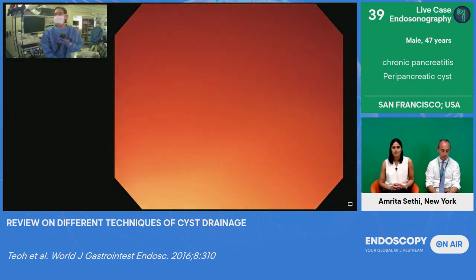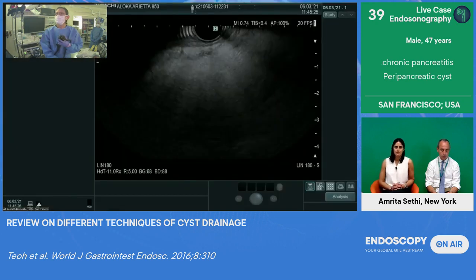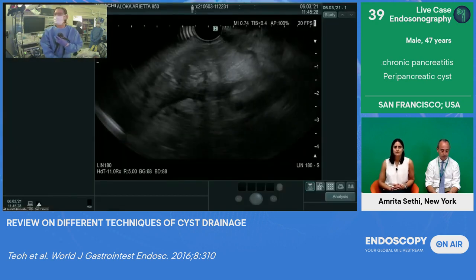Just need a quick moment so we can switch to the ultrasound view for you. No problem. And so what will you be immediately looking for? There we go. Now you should have the ultrasound view.